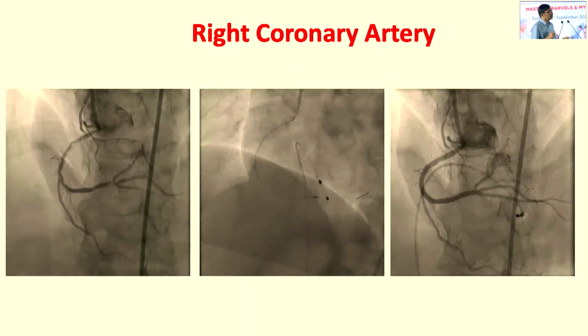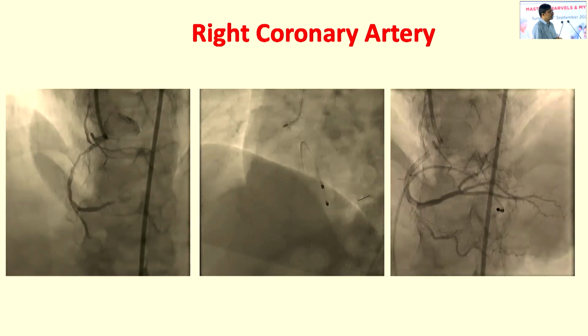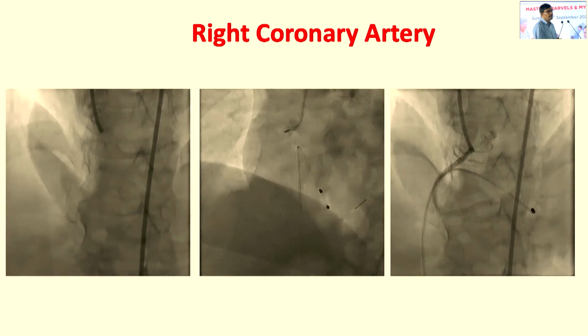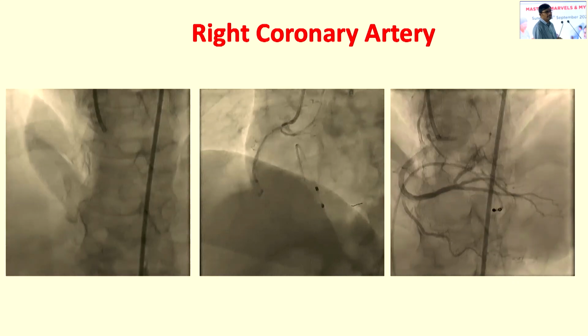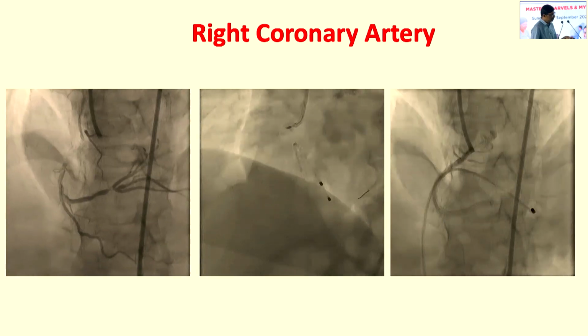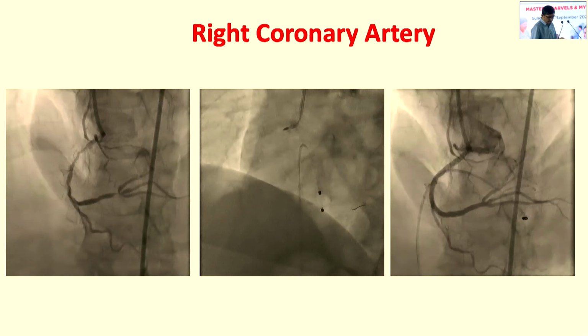Particularly when you achieve good lumens, good stent areas, these results are going to last longer. So these are the type of patients who, in olden days, if not suitable for surgery, were managed only with medicines, and could now be safely treated with all this new technology. So in this patient, like bypass surgery, all the blood vessels have been addressed with your calcium modification strategy. Thank you.